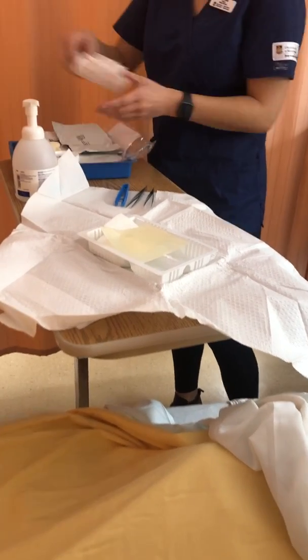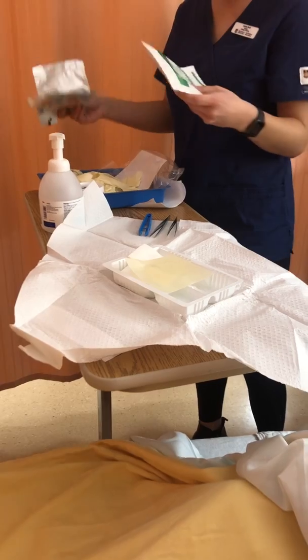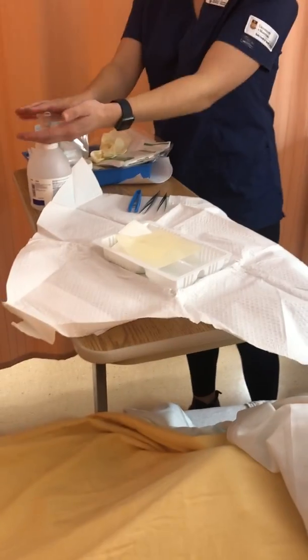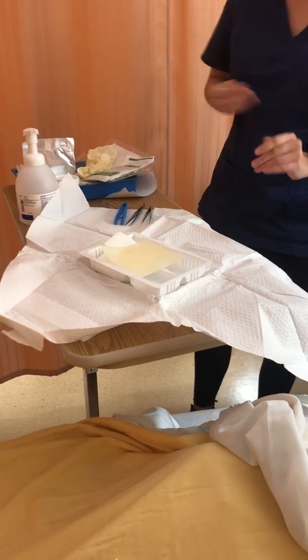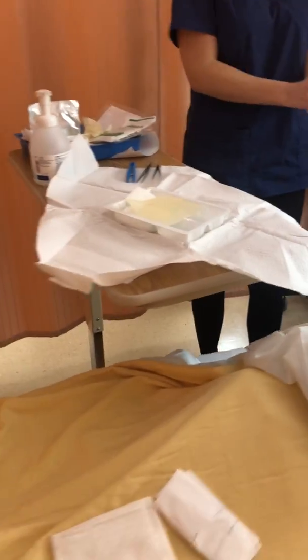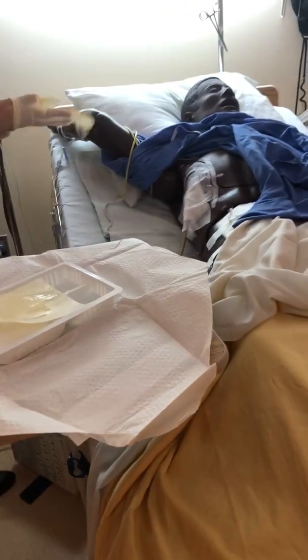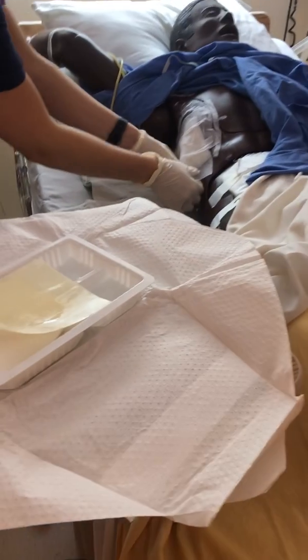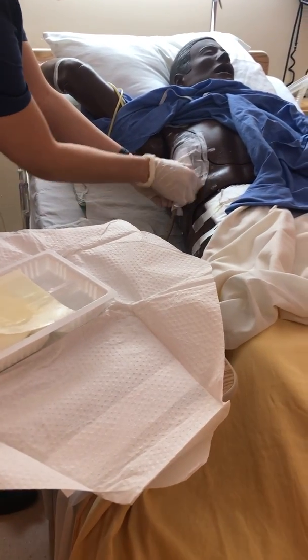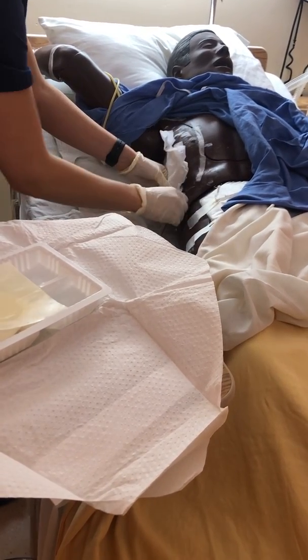Then I have my Mefix here for later. And I have my sterile gloves. Okay, so I'm going to do hand hygiene again. Okay, Bryson, I'm going to take off your old dressing now. So for this, I want to make sure that I'm stabilizing the tube to make sure I don't pull it out when I'm taking off the dressing.